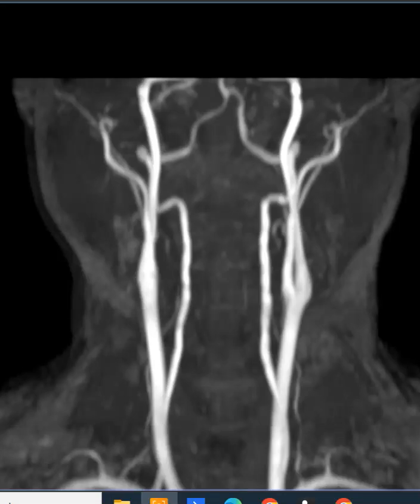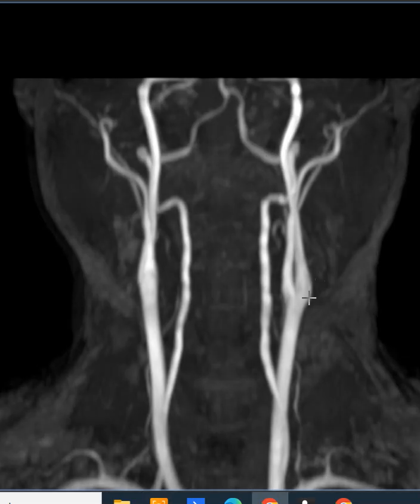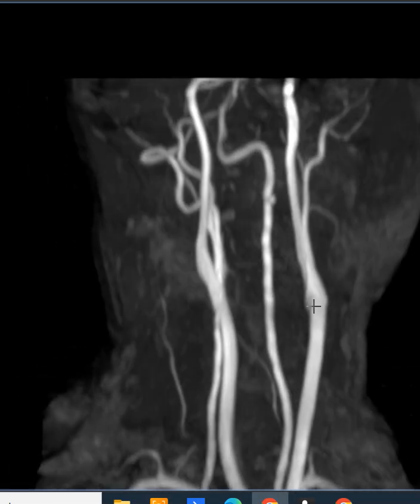Hello, this is Dr. Gay from First Sick MRI, and this is a patient who had a normal MRA of the blood vessels of the neck. An MRA is magnetic resonance angiography.